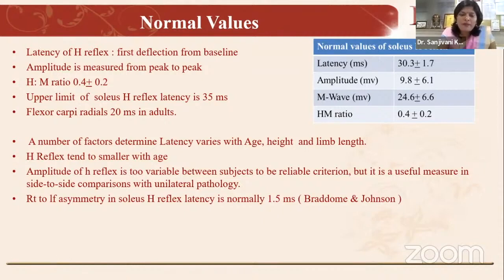In NCV also, it depends on age. As we all know, as our age increases, nerve conduction gets disturbed, meaning impaired. So according to that, it will vary. Then according to height also, because height affects the transmission of the action potential. So that will vary according to height and limb length. Then H reflex tends to be smaller with age.